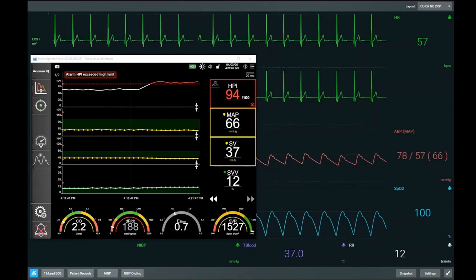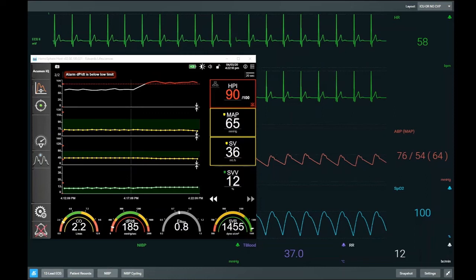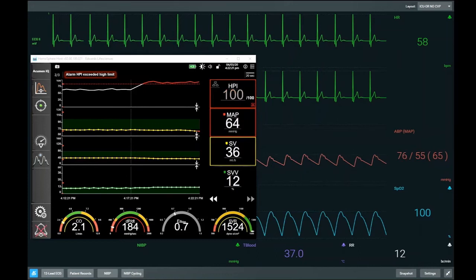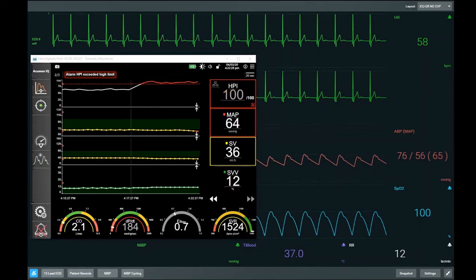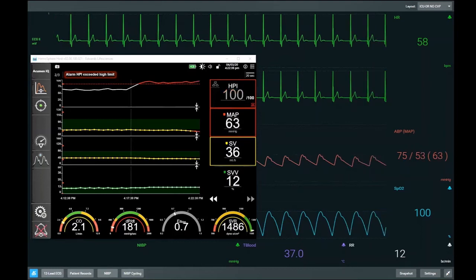Going back to the simulation, HPI has been raised for a little while and is now at 94. Our MAP is now 66 — almost at the cusp of our hypotensive threshold. Stroke volume is starting to drop, decreased from 41 down to 36. SVV is 12, so at the cusp of being a preload responder. Cardiac output is relatively unchanged, but DPDT is now 185. Bearing in mind our baseline was around 250 prior to induction, that represents around a 20% drop in contractility. We've just gone officially hypotensive — MAP less than 65 — and notably our HPI gave us almost four to five minutes of warning before this event.